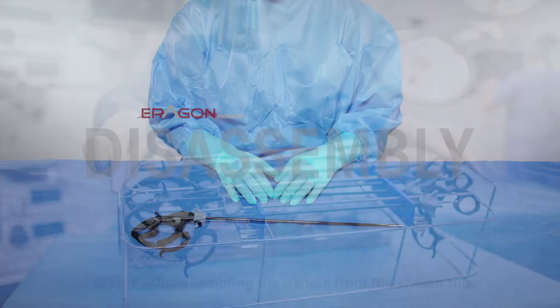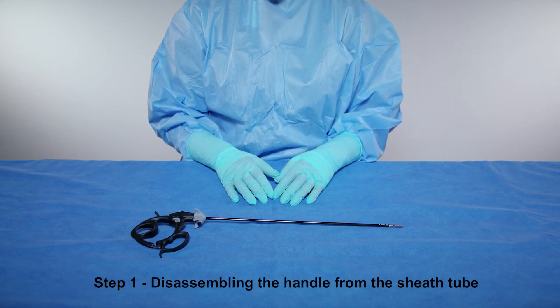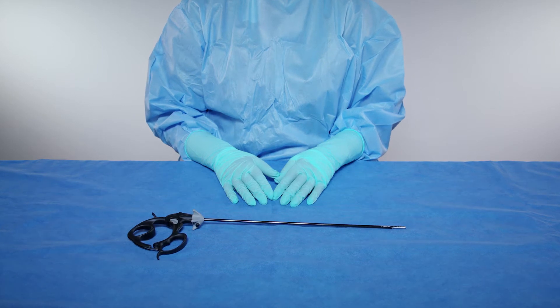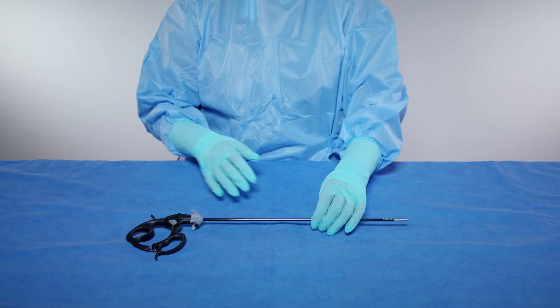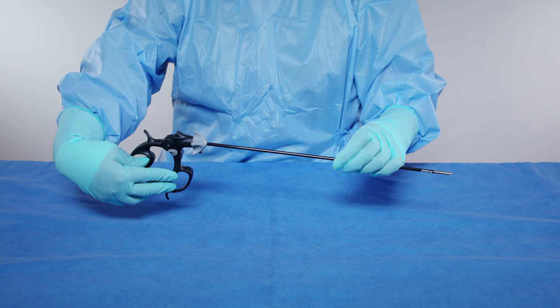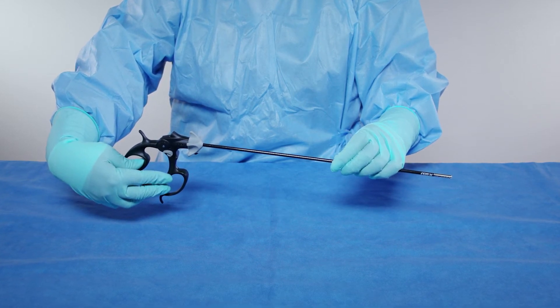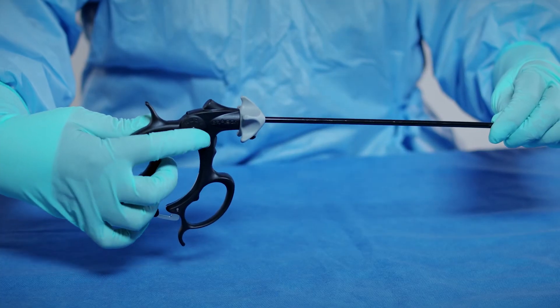Step 1: Disassembling the handle from the sheath tube. Grasp the fully assembled instrument with one hand on the sheath and the other on the handle. If a ratcheted handle, disengage the ratchet by gently pushing the locking lever up, then open the handle completely.